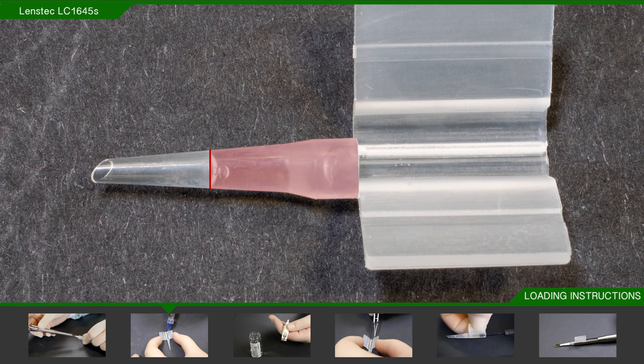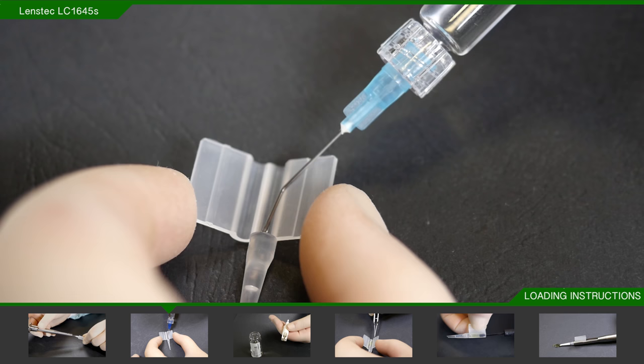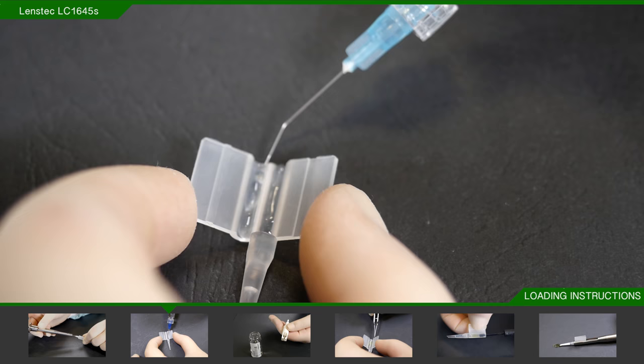After 30 seconds, you may have the choice to continue using the cartridge with saline only, or if you prefer, you may use viscoelastic. If you choose viscoelastic, then fill both channels of the loading chamber with a moderate amount.